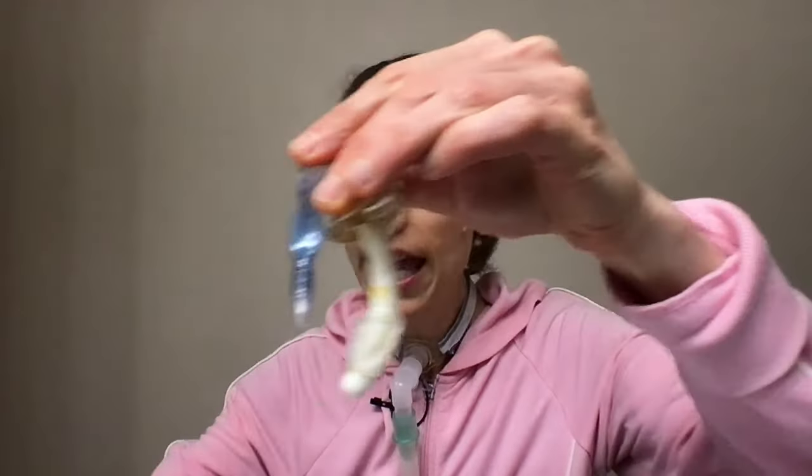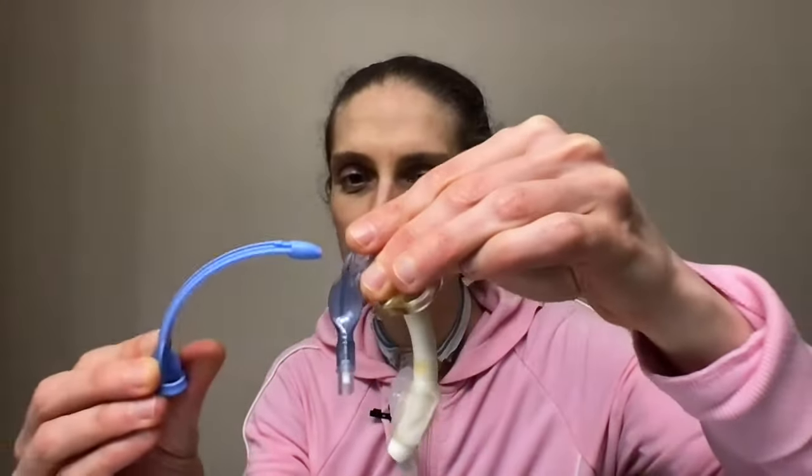Let me demonstrate. Here is your tracheostomy tube and you're saying, oh, I got a mucus plug. I can't breathe. What am I going to do? One thing you can do is, if you do not use an inner cannula, you can pull this out and very carefully insert a clean obturator inside.